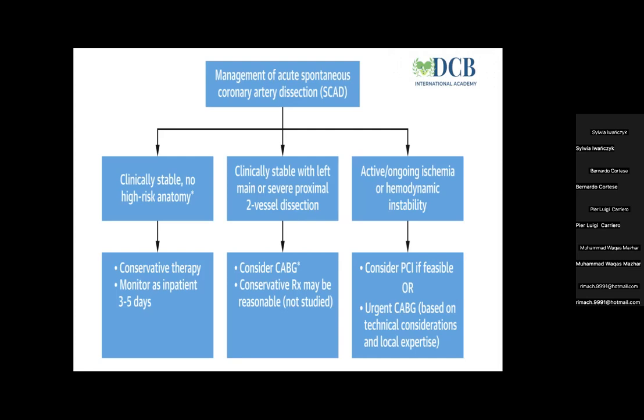And then you should land with a stent at least 1 centimeter distally to the propagation of the dissection, in order not to squeeze the hematoma and propagate the dissection, which is still a risk. So this is why the key message is that you should not treat spontaneous coronary artery dissection unless they are leading to acute ischemia of the myocardium or they are involving the proximal part of the vessels. But if you have to stent, you have to try to understand where the hematoma is propagating to and try to fix it.